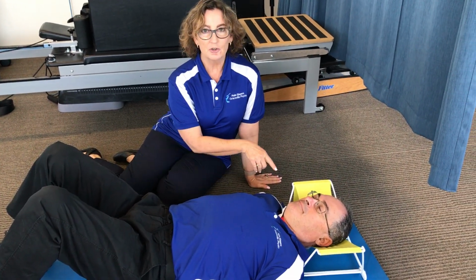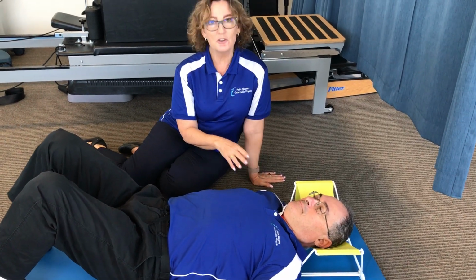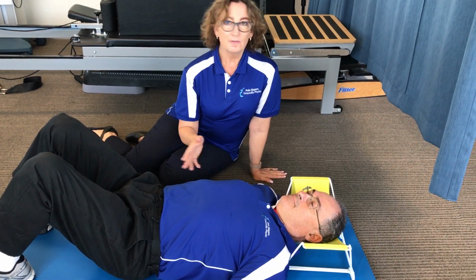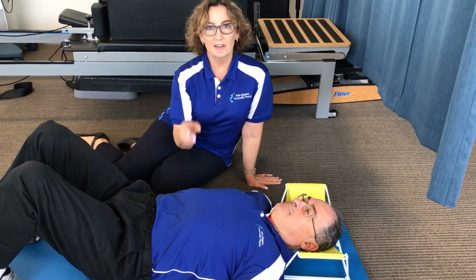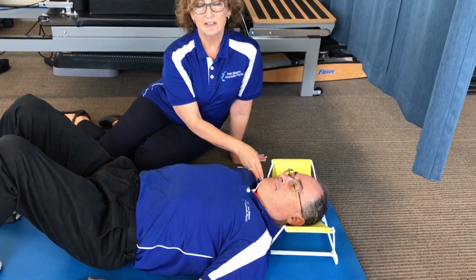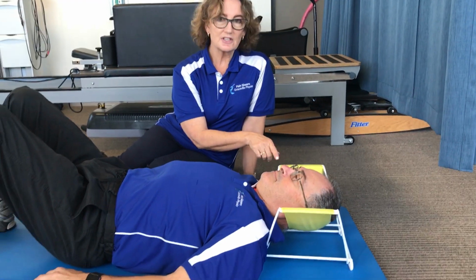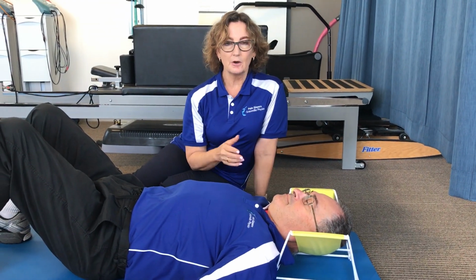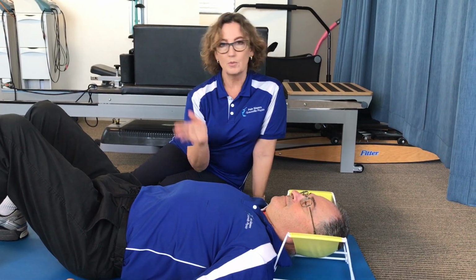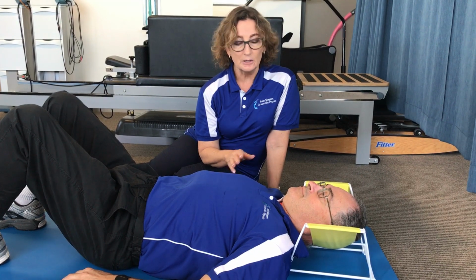So I've got George on the Neck Tek, and we've got some videos on our Facebook page about Neck Tek. You don't have to do this exercise on the Neck Tek, but if all of your stress and tension is coming from your neck, the neck becomes overly sensitized at the base of the skull. So lying with the head in the Neck Tek helps to relax that part of the neck which is attaching to the skull and hopefully desensitizes it a little bit.